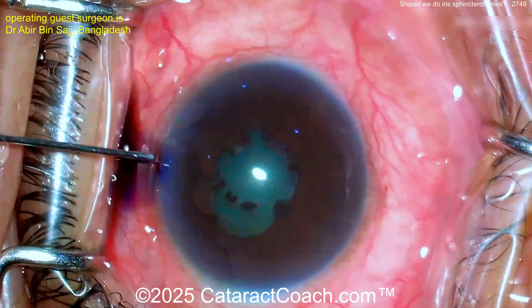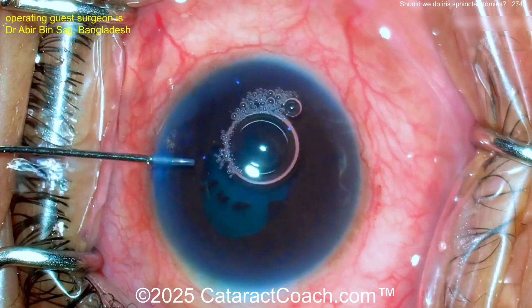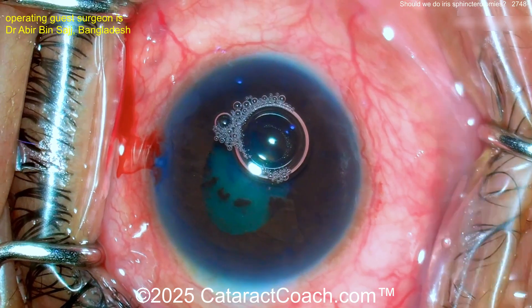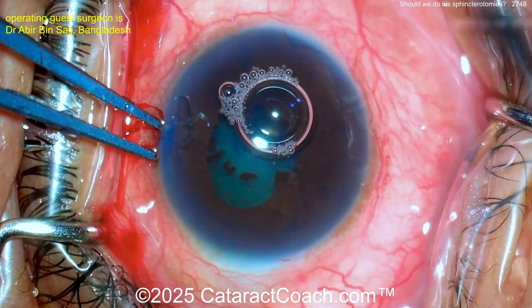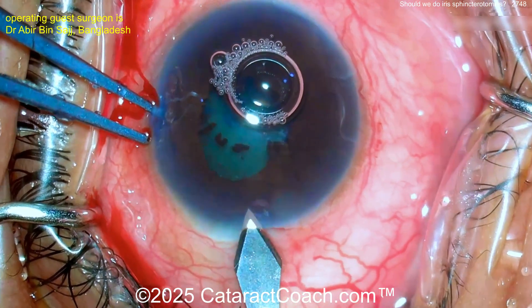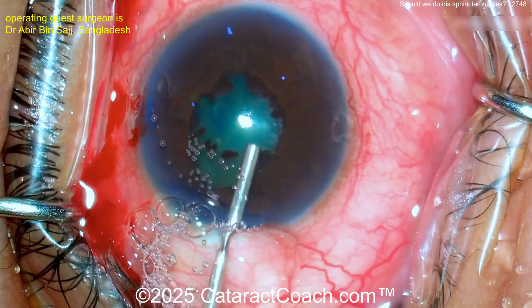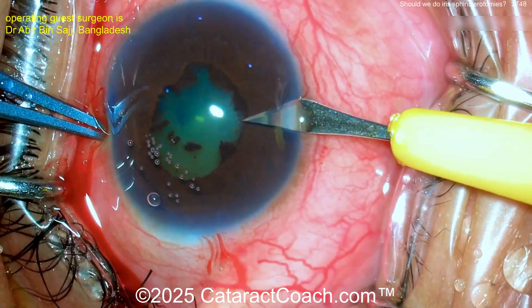Here's the paracentesis going in and a little trypan blue. I don't do it this way — I like tiny droplets of trypan blue placed under the iris, so when you expand the pupil you actually have stained iris, because this method only stains the part of the capsule that's exposed right now. Here we're making the main incision, putting some HPMC viscoelastic inside the eye, and now another paracentesis.